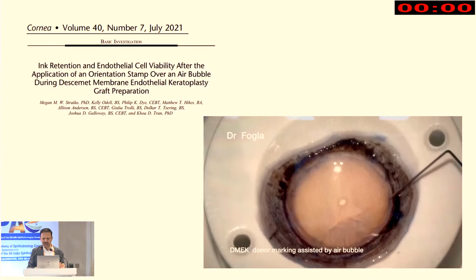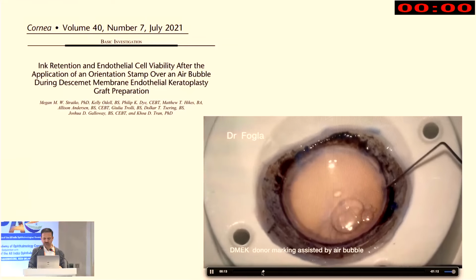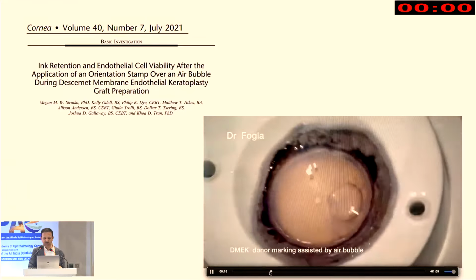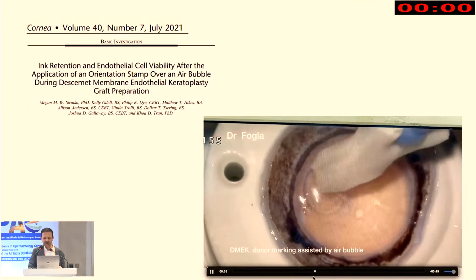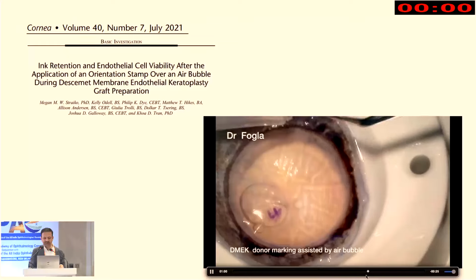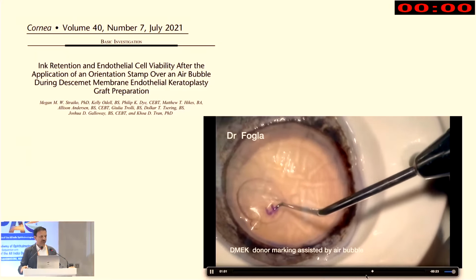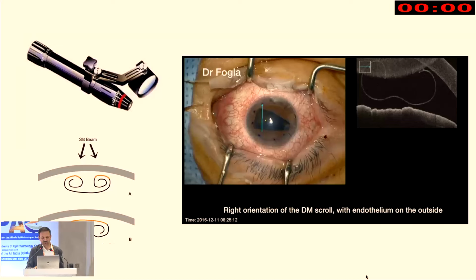This is again something to show you how to mark without doing a stromal punch, where you put a small air bubble in between the folded DM, and then you can dry the surface and you can just mark on the surface. The advantage of this is that you can use the stromal tissue for doing a DALK surgery, because you have not created a stromal window. You can look at the orientation on intraop OCT as well.